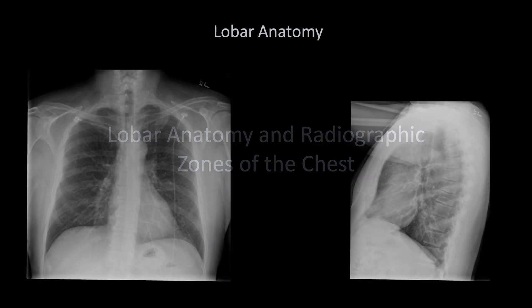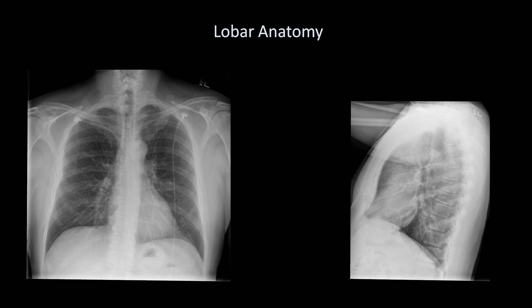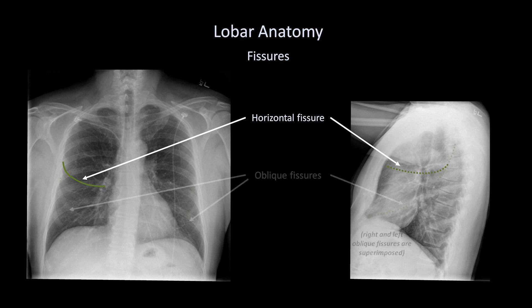I'll start by discussing lobar anatomy and radiographic zones in the chest in order to accurately describe the location of a focal lesion. The horizontal fissure of the right lung is typically the only fissure visible on the PA view, being roughly horizontal at the level of the hilum, and is generally not visible on the lateral view. The oblique fissures run at oblique angles to the x-ray beams in both the PA and lateral views, so they are usually not visible in either.